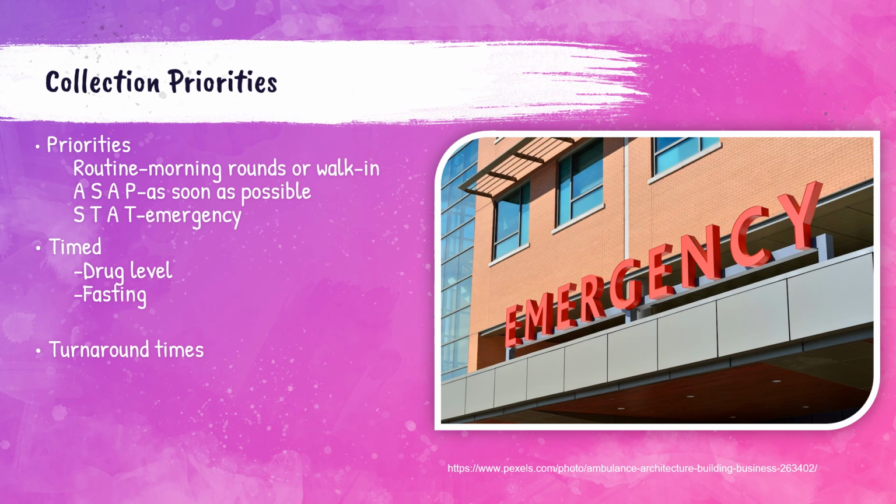Collecting timed specimens incorrectly, so collecting them at a different time than when they are ordered, can result in a false elevation or decreased result. Some tests also require fasting. In these cases, the phlebotomist must ask the patient if they have been fasting. The patient is normally in the basal state in the morning when the patient has been fasting 8 to 12 hours. If the patient indicates that they are not fasting, the phlebotomist must put this in the record.